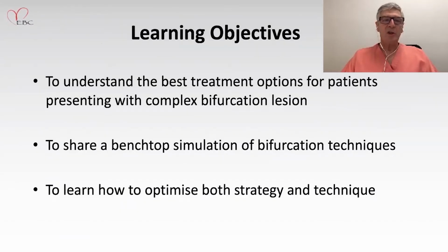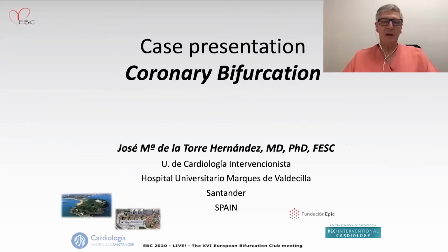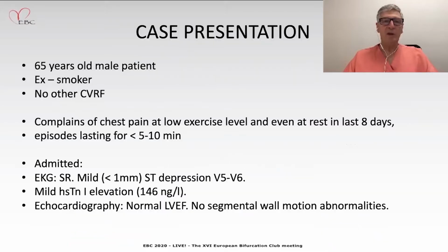The learning objective of this session is to understand the best treatment option for patients presenting with complex bifurcation lesion, to share a benchtop simulation of bifurcation techniques during the live case, and to learn how to optimize both the strategy and the technique. The case will be performed by José María de la Torre Hernández from Santander. I will describe the case.